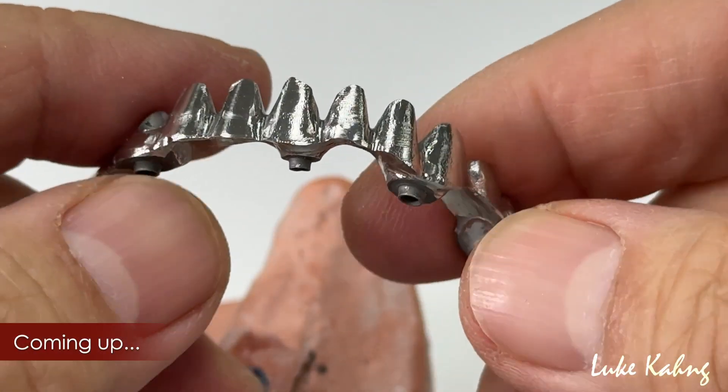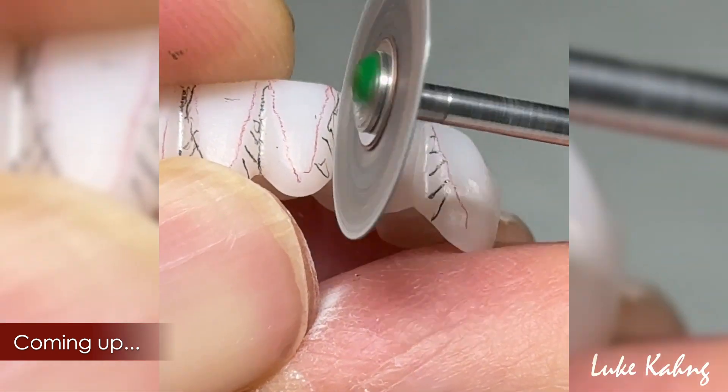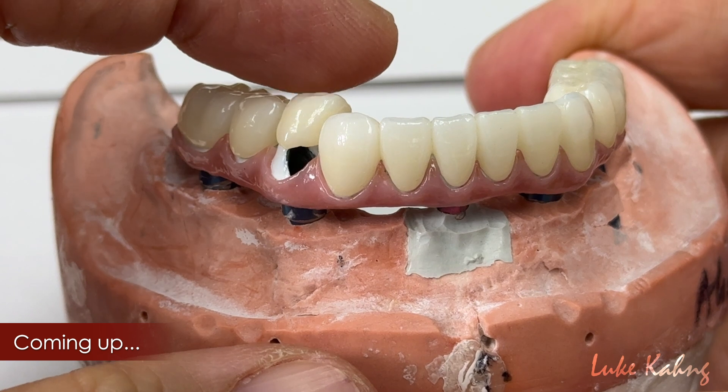After finishing the work, the doctor will put it back to the patient's mouth, and then this is temporary cement on top of this, so we cover it just like that.